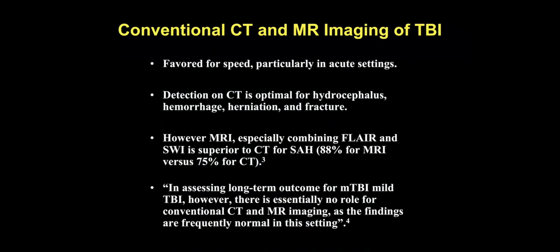That means that if an individual has a conventional CT and MRI without advanced imaging, without quantification of any advanced techniques, and the scan is called normal, all that means is that the neuroradiologist or the radiologist, because it's not always a neuroradiologist looking at the scan, examining the scan cannot see anything that they can visually identify as abnormal that they can report. But that doesn't mean there isn't more subtle disease that could be detected with the right combination of advanced imaging and related quantified approaches. So that's very, very important to understand right off the bat.